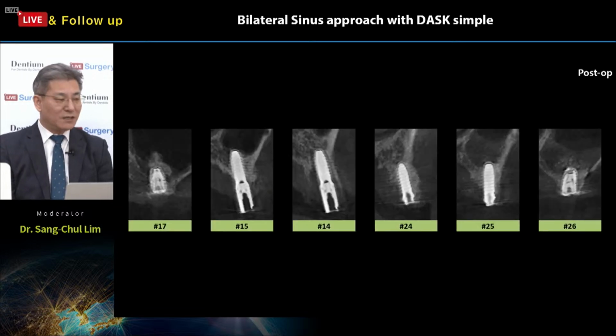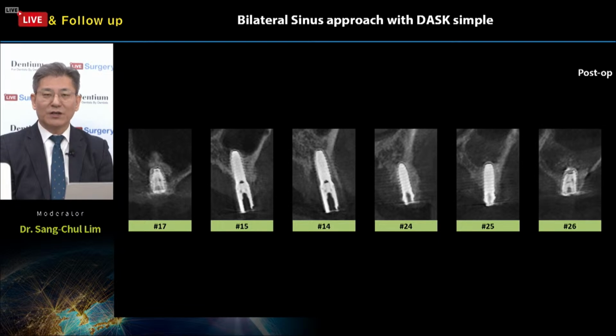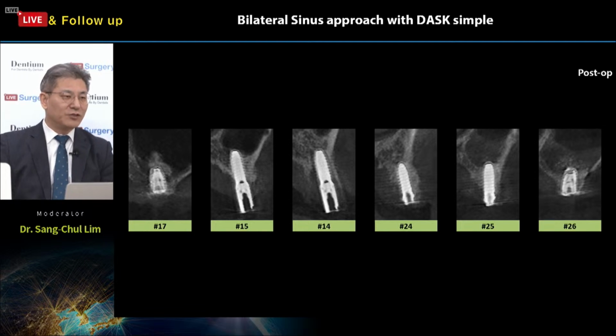Okay, what about the cone beam CT? As you can see, the cone beam CT shows a very nice, good result. Numbers 14 and 15, all the implant surface fixtures are installed in the host bone very strongly, so that is why we connect the comfort cap. Numbers 24 and 25 are also well installed in the host bone. However, this one is not as strong as numbers 14 and 15, so this one just stays in there. And in the number 26 area, even though there was sinus membrane perforation during the crestal approach, it was very well overcome by the lateral approach with bone grafting materials.